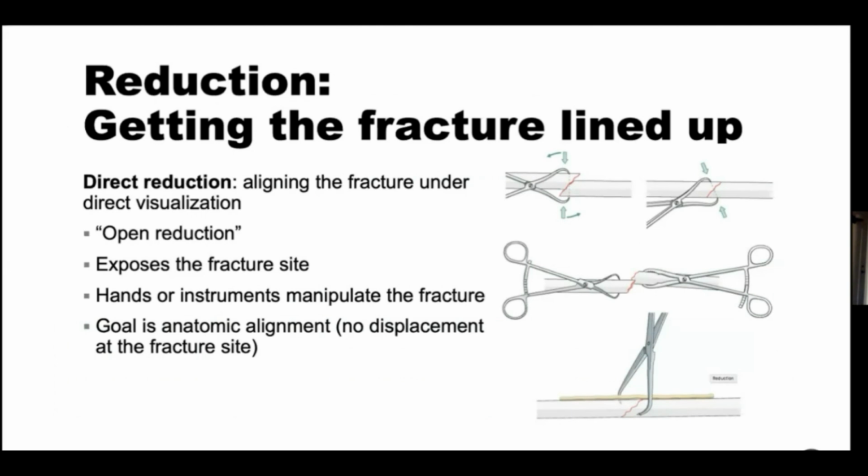In the next couple of slides, I'm going to demonstrate some different pathways to achieving each of these steps. So I want you to pay attention to 2 ways in each of these different pathways to achieve the desired goals. So we're going to start by talking about fracture reduction and how you get the fracture lined up.